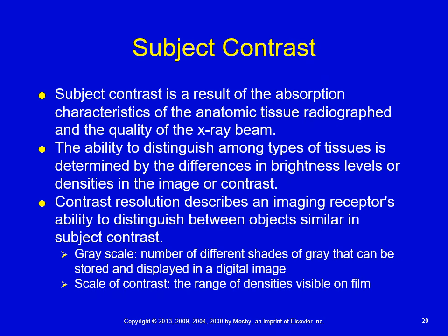We're talking about how strong the X-ray beam is. Is it able to penetrate the different tissues that it is interacting with? With regard to those differences in tissue and tissue thickness, that is what's going to create those different shades of gray on the image. So that leads us to those terms at the bottom, grayscale and scale of contrast.